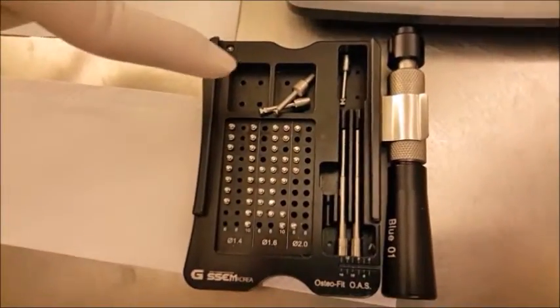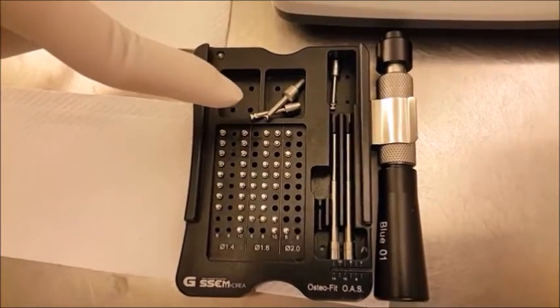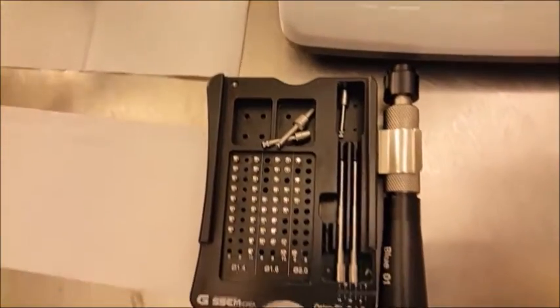With the micro implant kit, we have our contra angle, contra angle adapter, and the contra angle extension arm. I'll show you how that works later with a pilot drill.